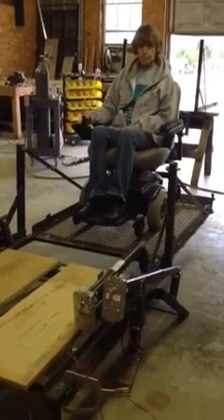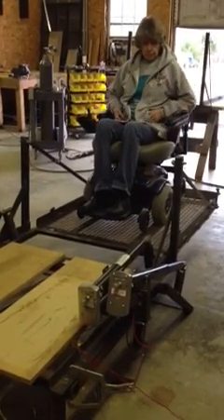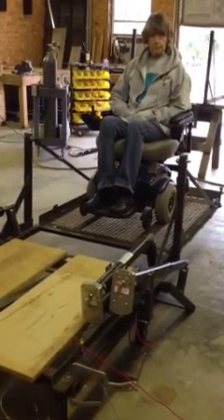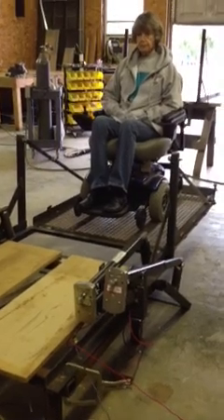Now normally on a finished product, that area that's open would actually be part of the floor of the golf cart. The floor of the golf cart will extend out to where the uprights are, so this all becomes part of the floor.